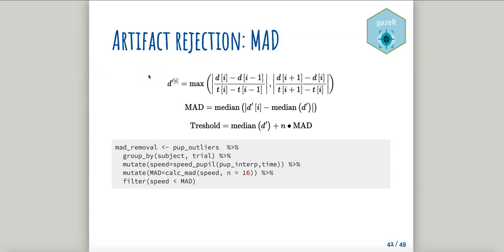You might also want to do a second pass of your data to look for large changes in pupil size between successive trials or samples. Dilation speed outliers are samples that feature a disproportionately large absolute pupil size change relative to their adjacent samples. In this equation, the absolute change between samples is divided by the temporal separation of the samples, producing the normalized dilation speed between samples.